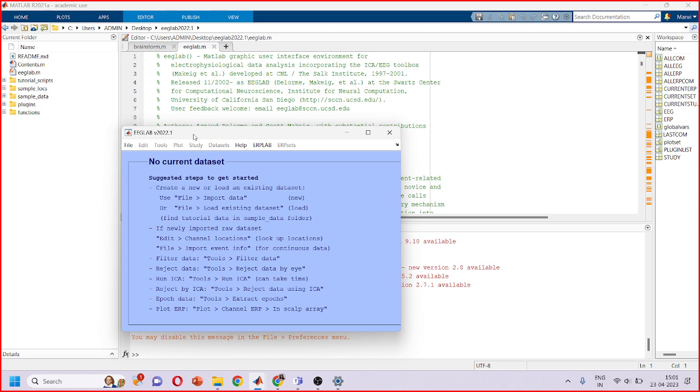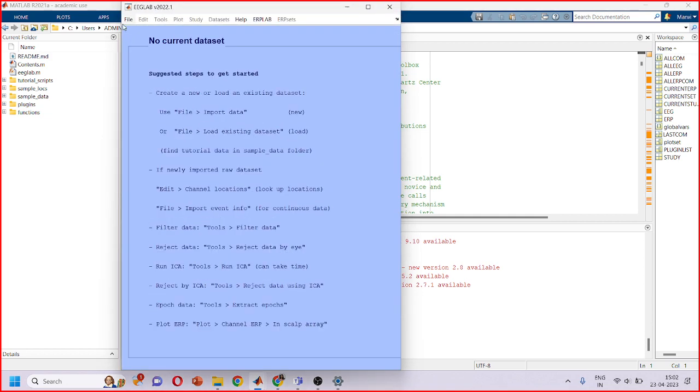For those of you who do not know analysis, it's a great start because I've shared the data, which is scrap data, but it's good data to look into to start with. For those of you who know things, if I'm making a mistake here, or if I can develop my steps further, please tell me, and we can discuss things so that we only improve together.